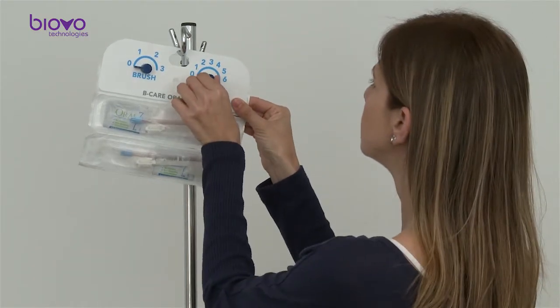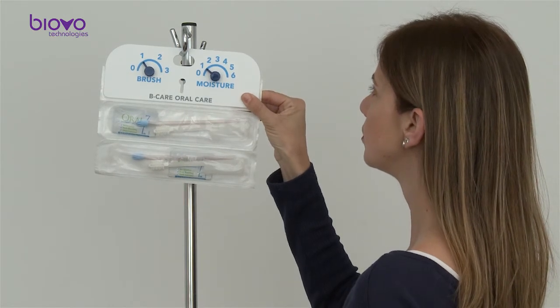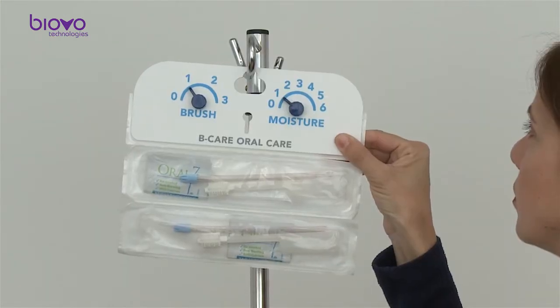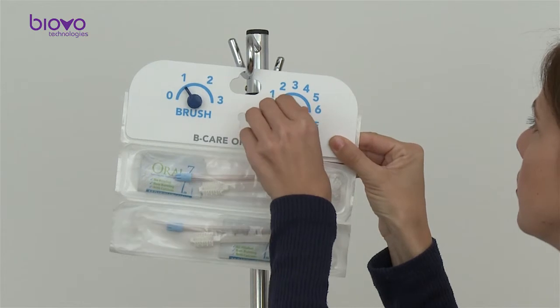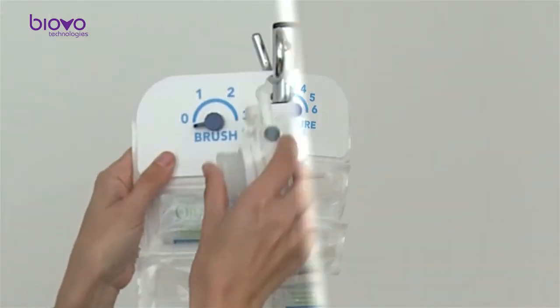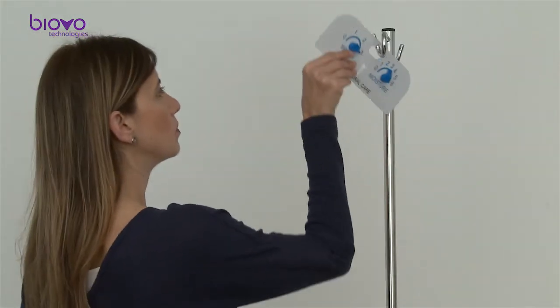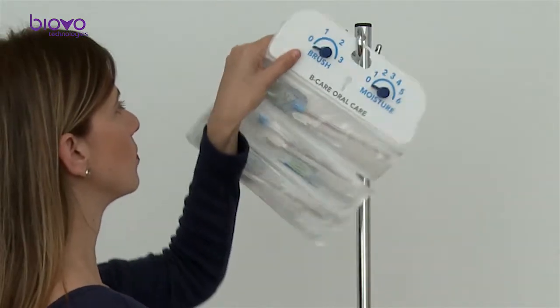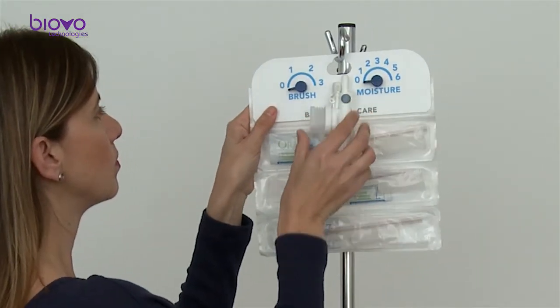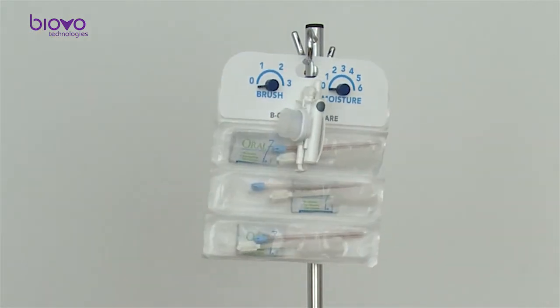Track the performance of the 24-hour oral care protocol with the counting dials on the board. You may perform and track the actions of brushing and moisturizing independently according to your protocol. Keep the handle for next use. On subsequent days, at the morning shift, you only need to add a new set of brushes and liquids on the board and keep the handle for continued use for the patient.